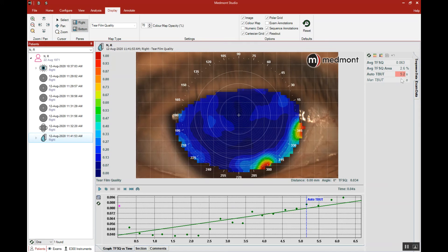The tear film surface quality test runs for as long as the patient can hold their eye open, to a maximum of 15 seconds. If the patient reaches a point where they need to blink, the third blink will stop the test. So two blinks to start, and a third blink stops the test.